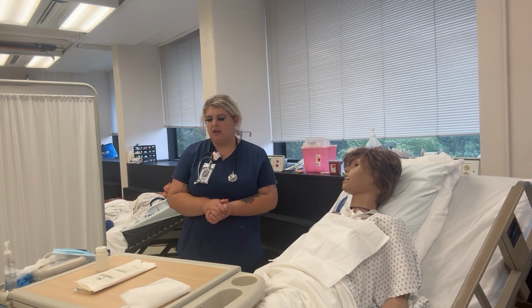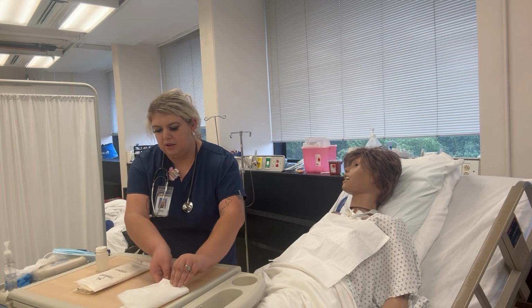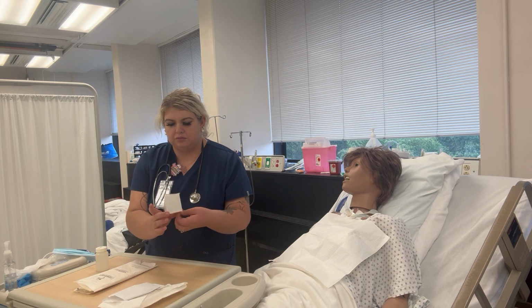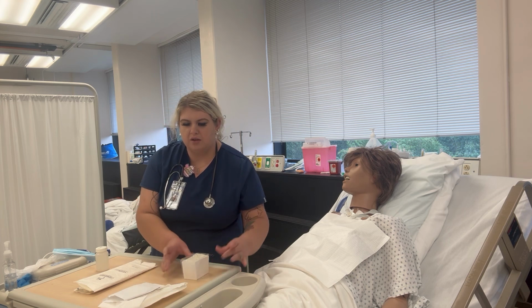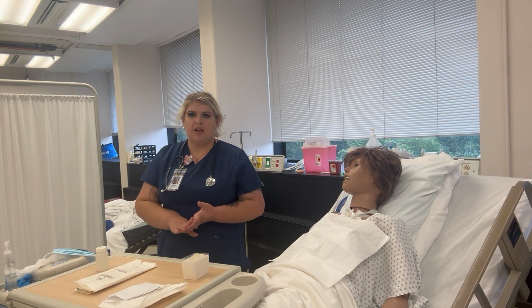Wash hands again. We're then going to go ahead and set up some of our sterile supplies. So when touching the box, you always want to make sure not to touch the inside, as that could break sterile field.